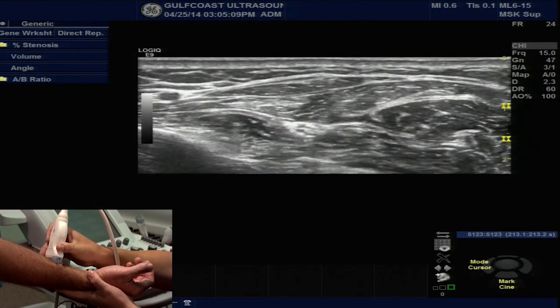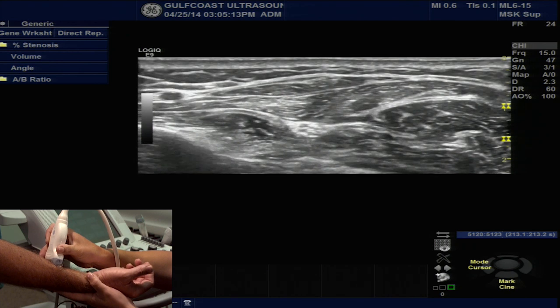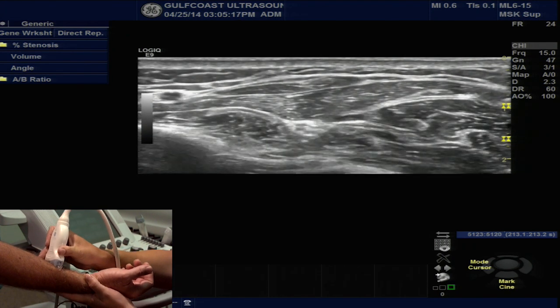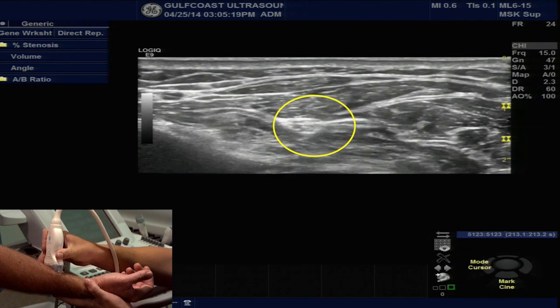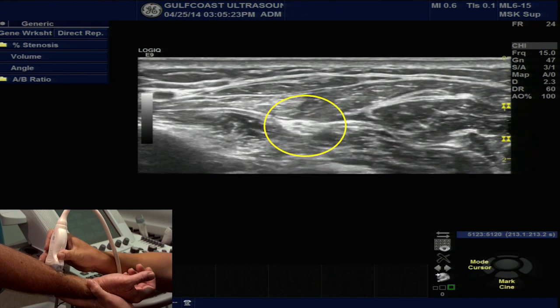In the mid forearm, if you don't see the nerve right away, try changing the angle of the transducer's beam by wagging the tail of the transducer slightly. You'll see a dramatic change in the echogenicity as you adjust that angle of inclination.